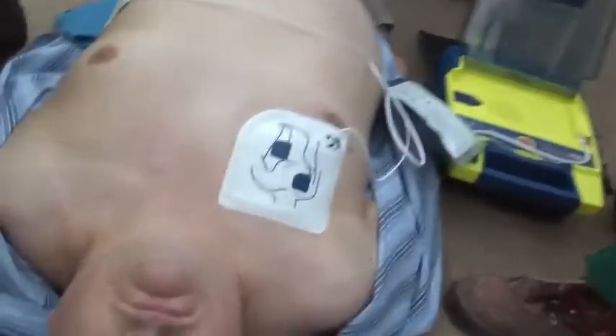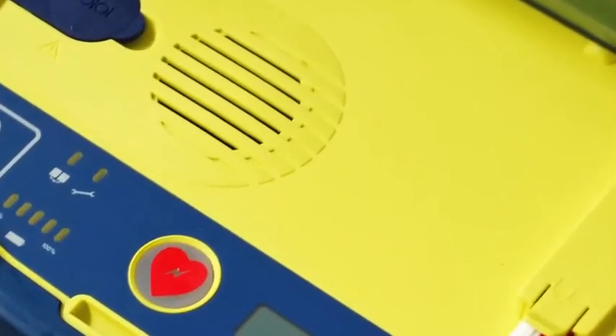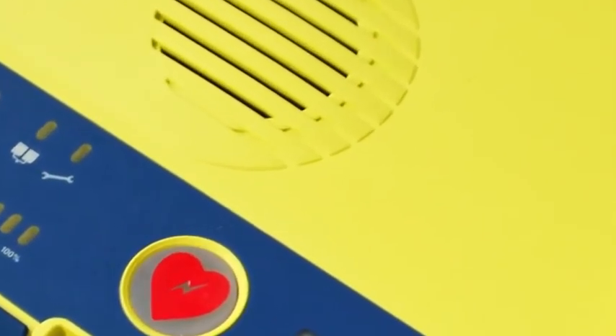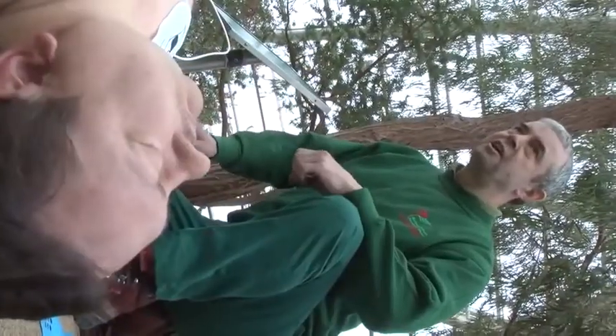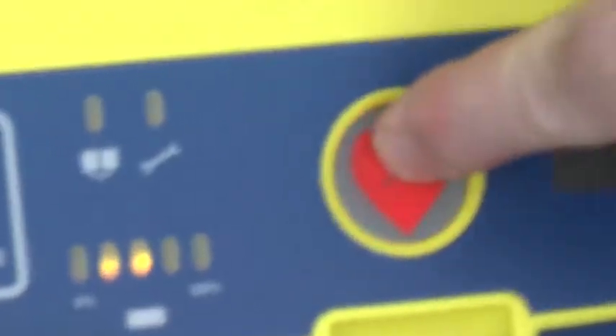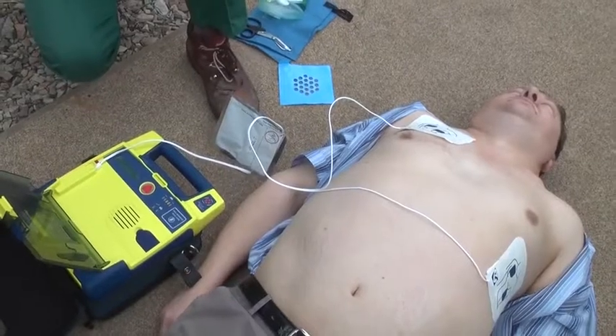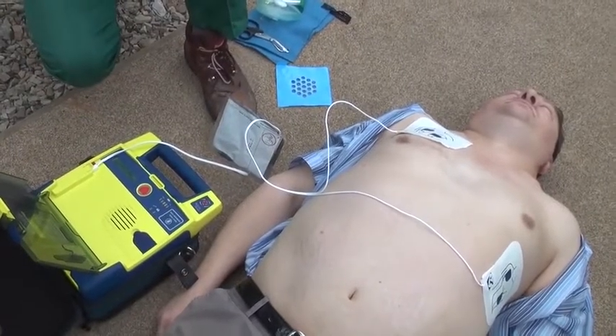Do not touch patient. Analyzing rhythm. Shock advised. Charging. Stand clear. Stand clear. Push flashing button to deliver shock. Shock delivered. It is now safe to touch the patient.